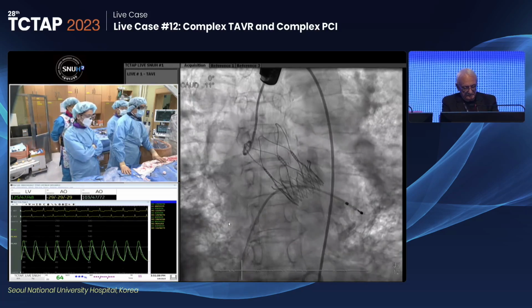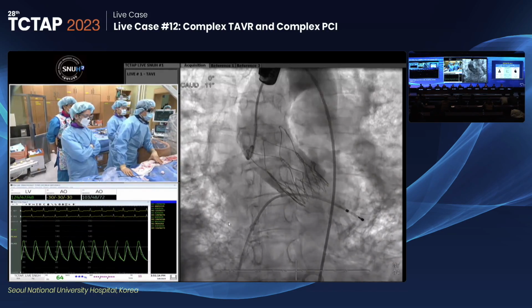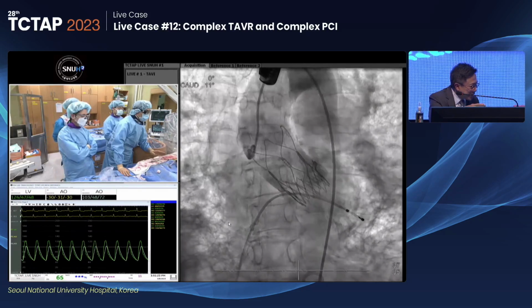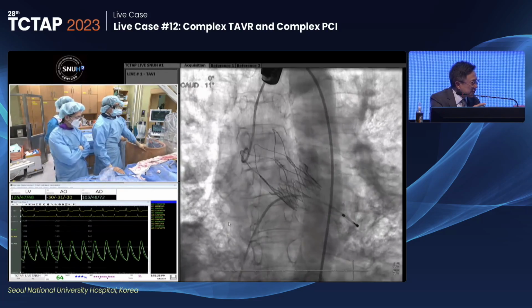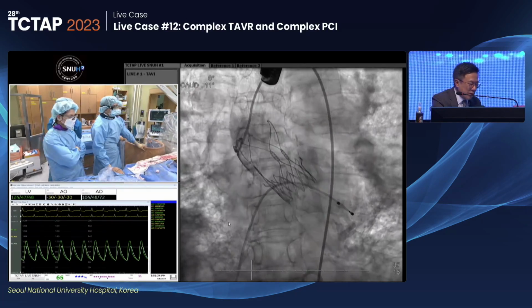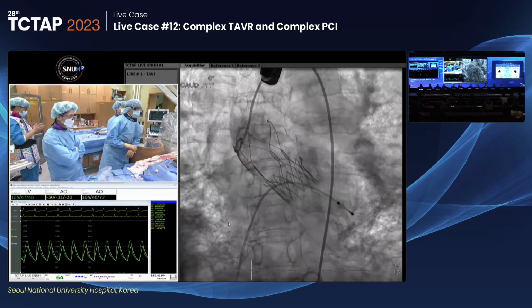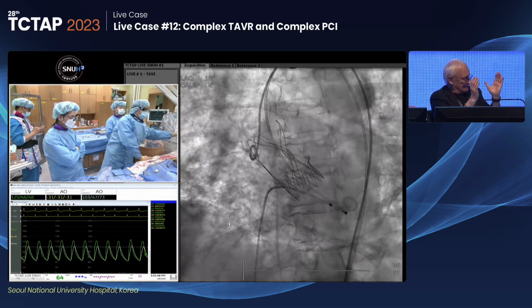I think it's fine. I mean, the trade-off between the strength of self-expansion versus how much you can push a calcified valve apart and keep them there. You try to say, well, you don't need as much, so that you have less pacemaker complication. But what you do is that the valve, this whole thing, is a little softer, and you can see it twisted a little bit. So the compromise is which way you want to go. What you could also see, the inflow was a little bit bent in. We saw this in the early days when the cover was too high. We had this little bend inside.